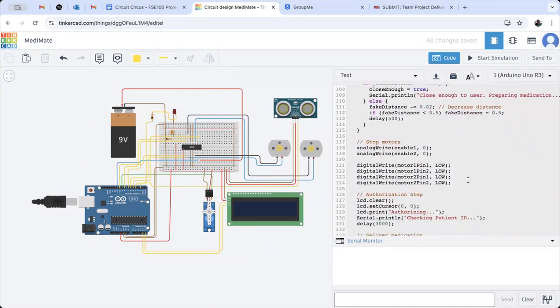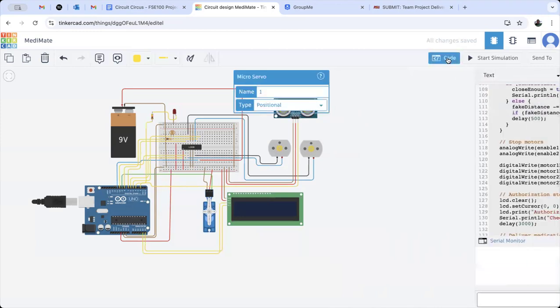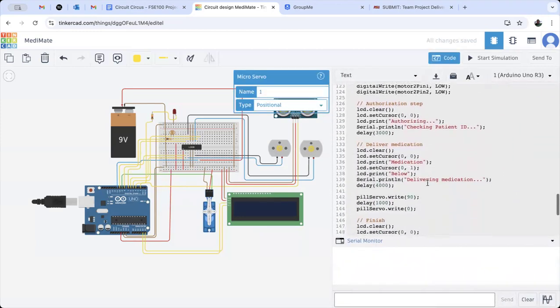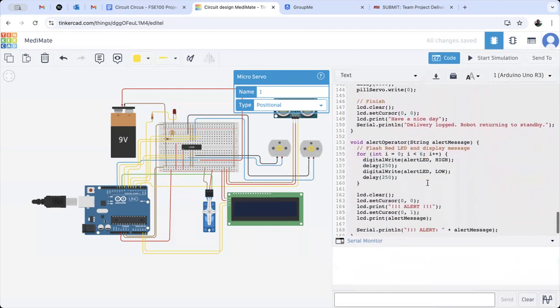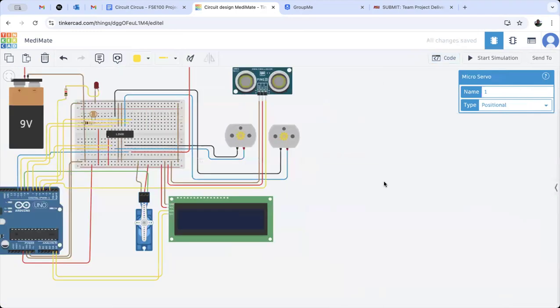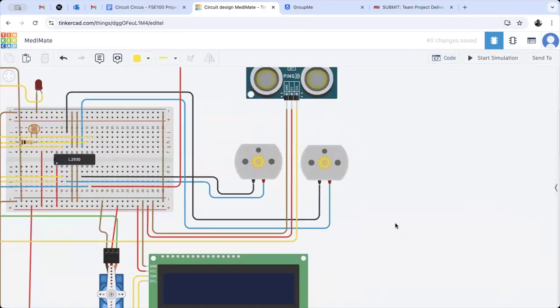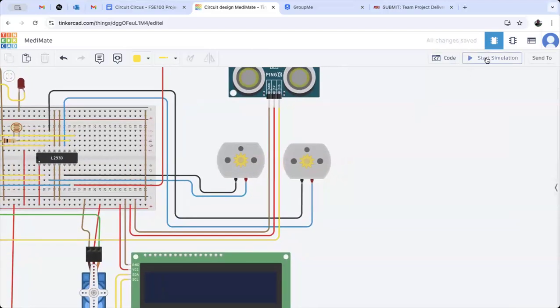And we go over here and it'll send a message, and then it'll actually turn on the microservo to dispense the medication. Other than that, here is just the medication being delivered, a friendly have a nice day, and going back to standby mode. And then when the alert does happen, it will flash the red LED. So let's quickly run this code. I want to zoom in just so you can see everything a little bit better. The LED will turn on when we need an alert.